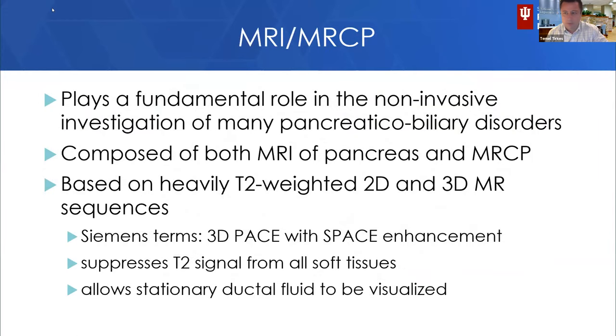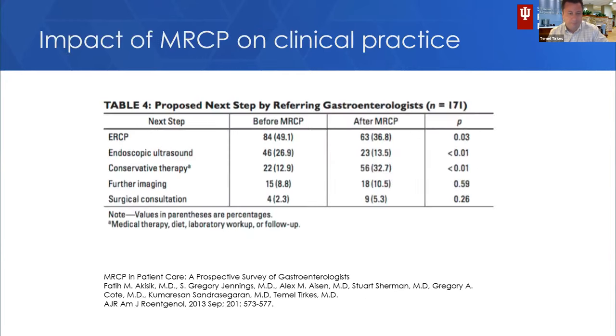All right, so MRI and MRCP play a fundamental role in the non-invasive investigation of many pancreatic biliary disorders. As I said, it has replaced ERCP for diagnostic purposes because it is non-invasive, and it contains both MRI and MRCP.